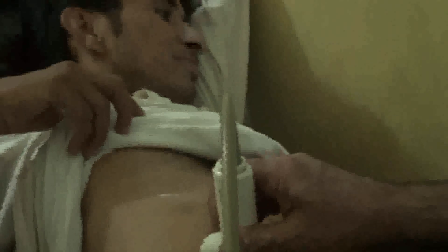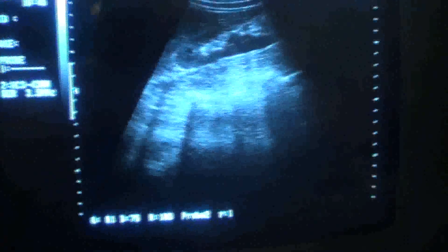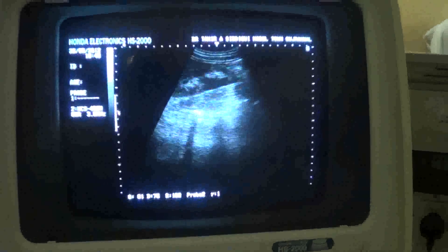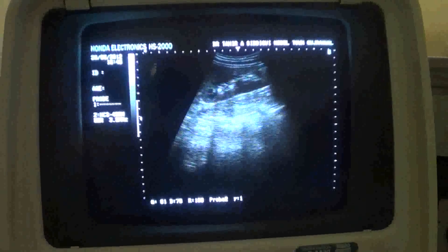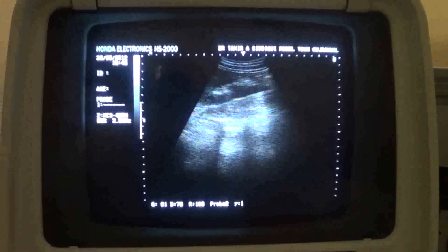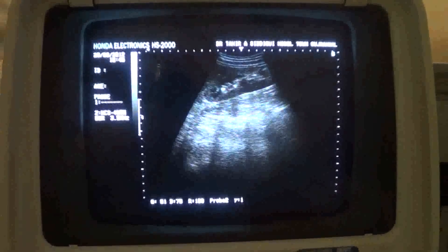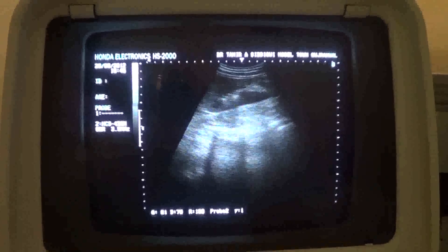We're looking into a renal colic case and let's see what we get on the ultrasound. We do see in the right kidney tiny echogenic areas giving posterior shadows.